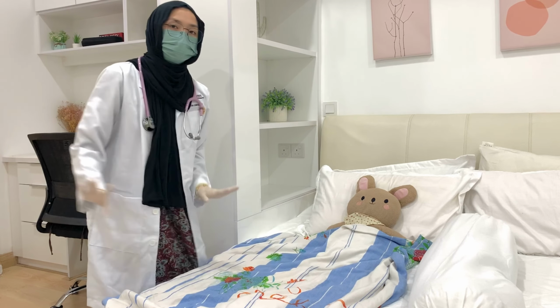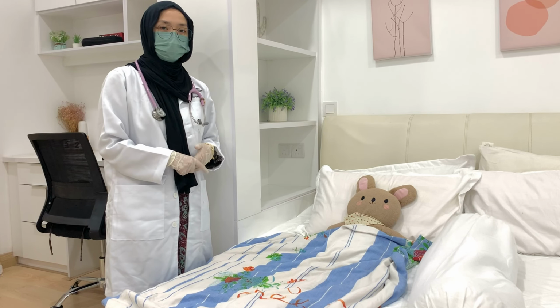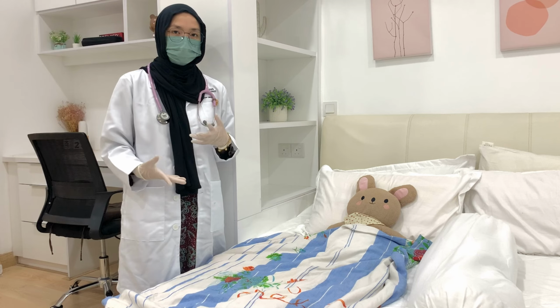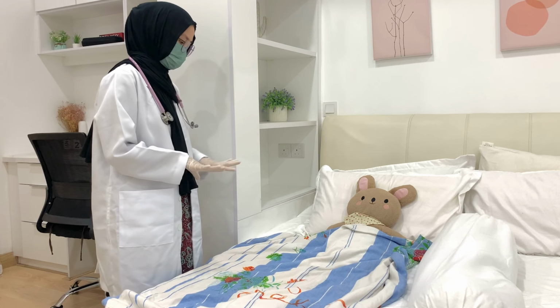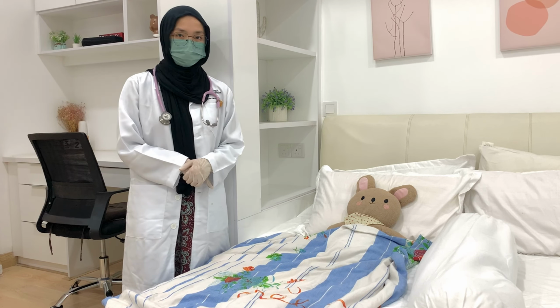Now I'm checking the area of skin where the catheter is inserted in order to confirm if there is any form of discoloration or any form of fluid we can see from the outlets. And from what I see, everything is perfectly fine.